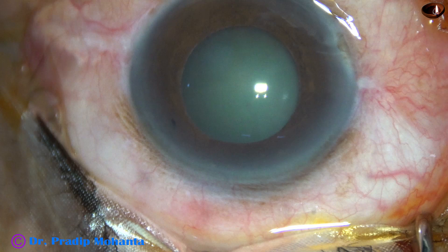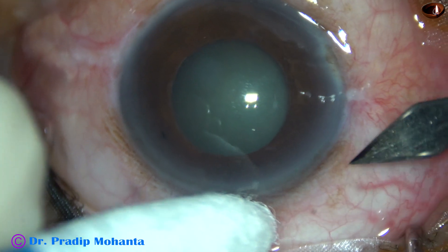Friends, this is a cataract with pseudo-exfoliation and weak zonules. Let us observe this surgery.